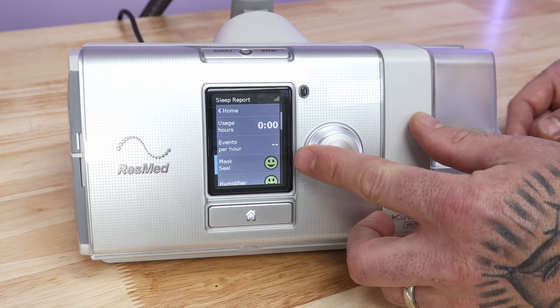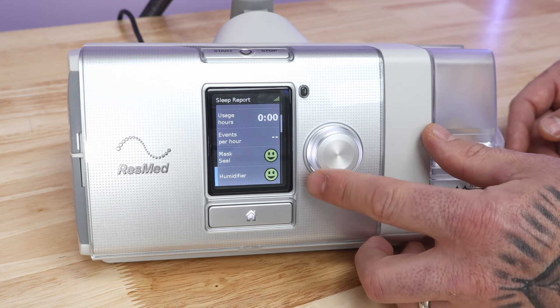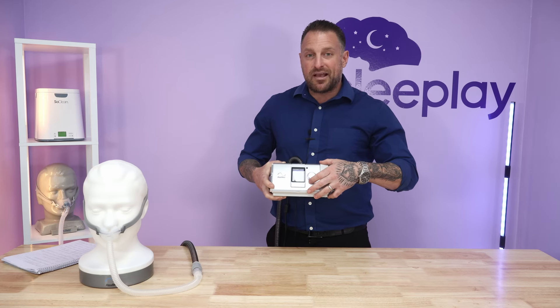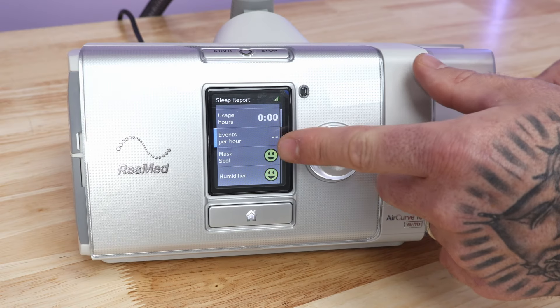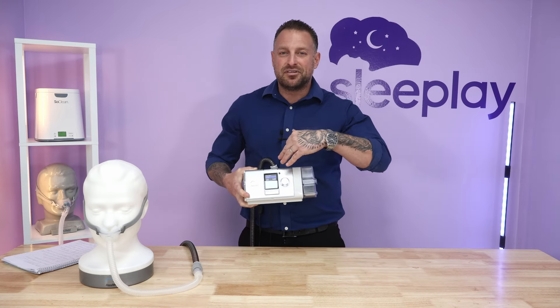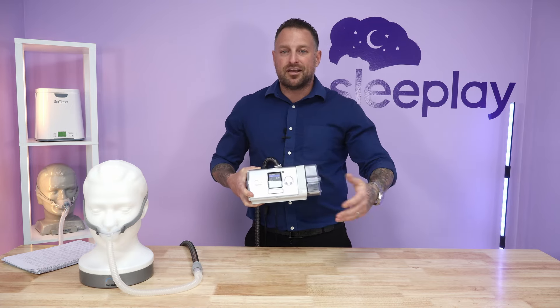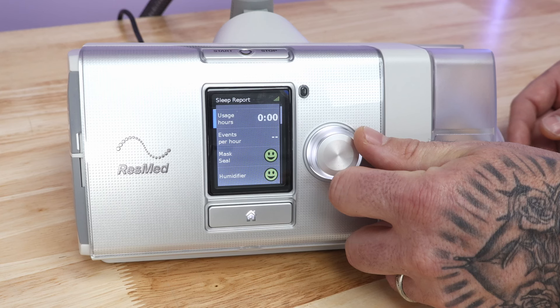The sleep report also gives you events per hour and your usage. A green face for mask seal is great; a green face for humidifier is great — if the humidifier shows red, contact your supplier. If mask seal is red but events per hour are five or below, you're still good. Usage shows you the last session — whether you had the machine on all night or just briefly. Hit the home button to go back to the home screen.